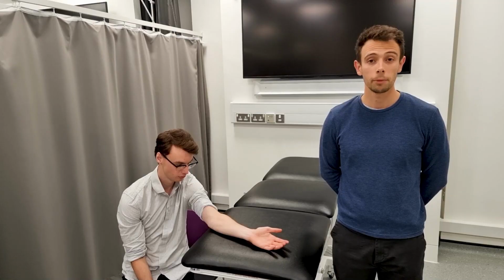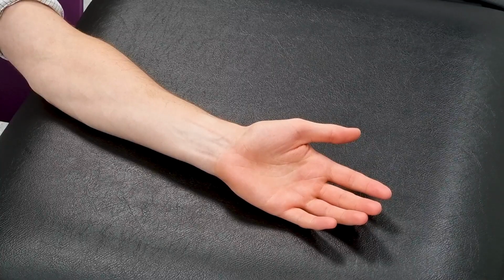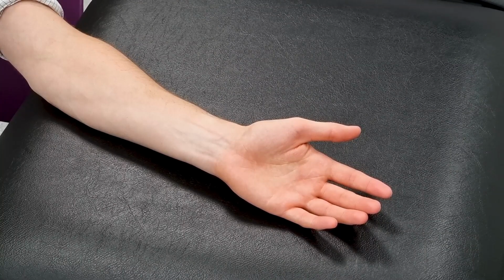In this video, we'll be exploring the surface anatomy and ultrasound images of the wrist, hand and posterior forearm. To begin with, we'll be looking at the surface anatomy of the palmar surface of the hand. The skin on the palm is thick and richly supplied with sweat glands. Remember, there are no hair follicles or sebaceous glands in this area.